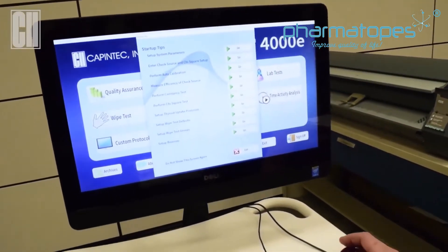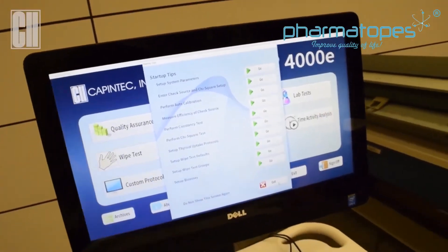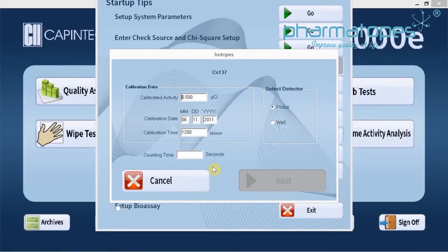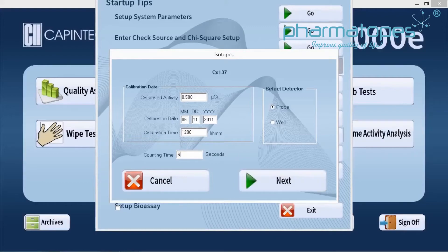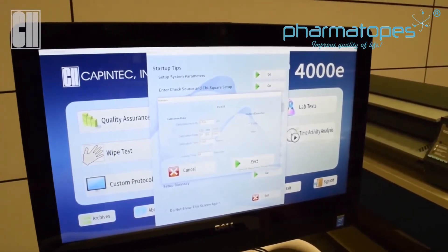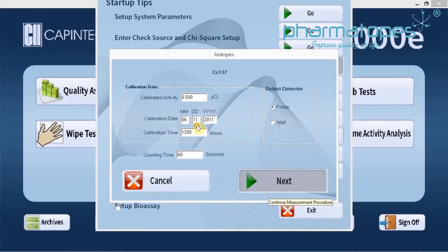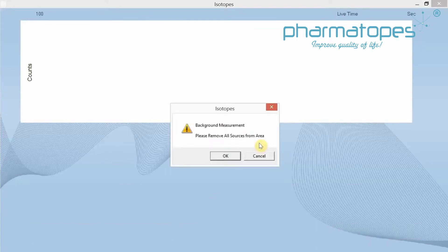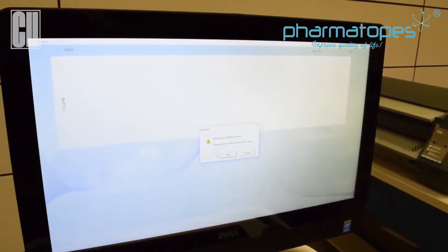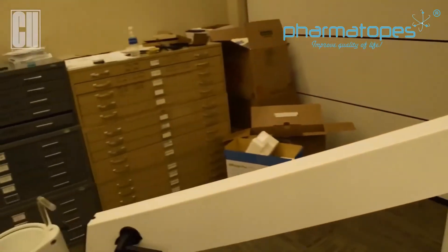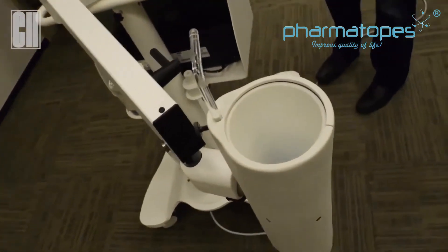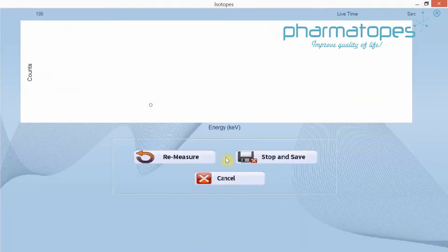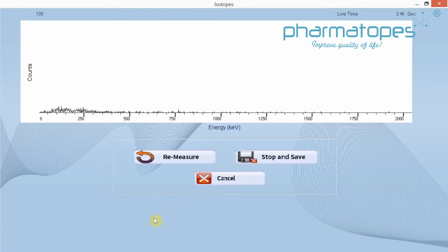Now we measure the efficiency of the check source. We'll measure efficiency, but this time we're going to select the probe detector and have the counting time set at 60 seconds. Once the settings are in there and we verify the source information is still correct, click on Next, then Start Procedure. We're going to do a background of the probe, so we want to make sure that all sources are removed from the probe. Click OK, and we'll count the background for one minute on the probe.